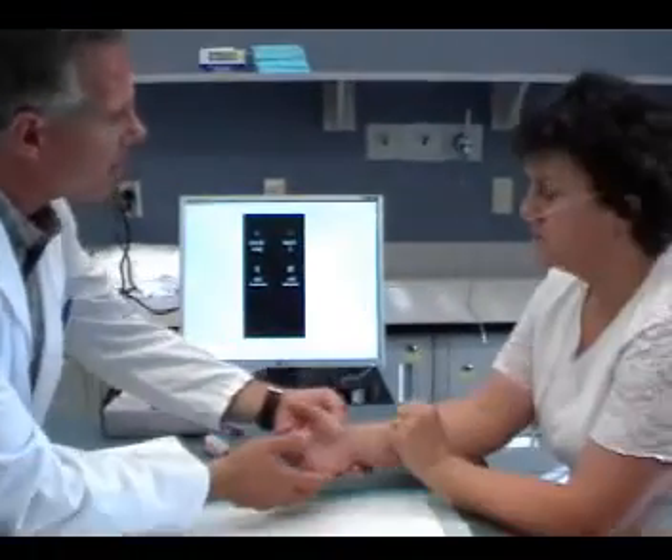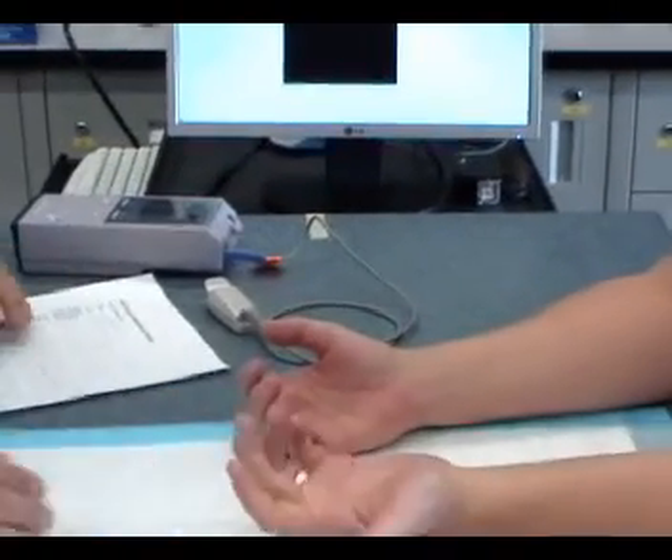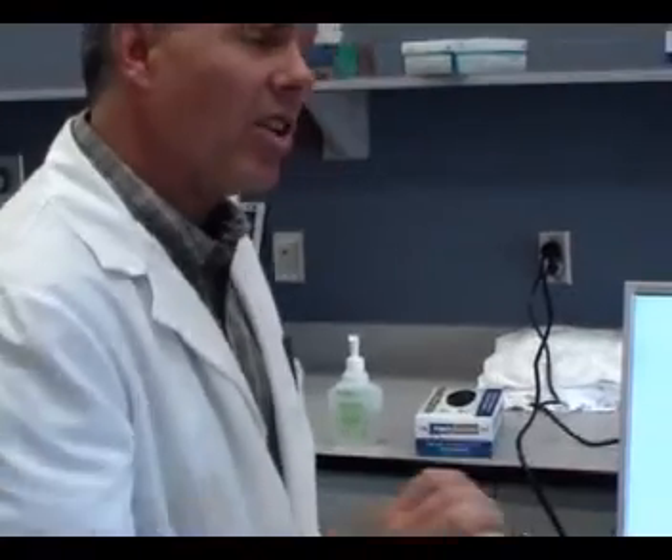I've already looked at your chart. I didn't see anything — oh, you just had blood done? Did you just have some blood work done? You had some blood drawn. Okay, that's a little bit different, because they did the regular blood work just up to your elbow there? Yes. So they got venous blood. This is particularly different because we're going to take a little bit of blood just from your wrist, right here, and the reason for that is because we want arterial blood.